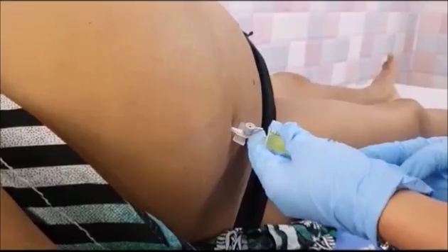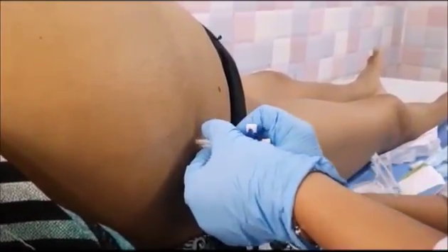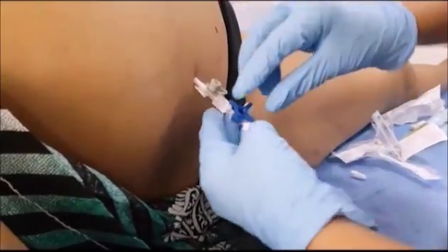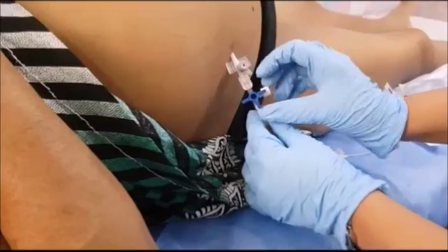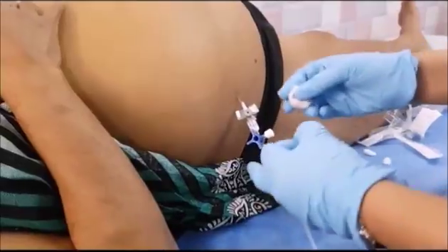But if we want to do a therapeutic tap, this is the continuation. We will attach a 3-way cannula, close it, then connect it to an IV set which is connected to a 500 ml normal saline bottle. We will then open this and decompress the abdomen. In this case the patient was having breathlessness due to massive ascites, and we have taken out 1 litre of ascitic fluid.